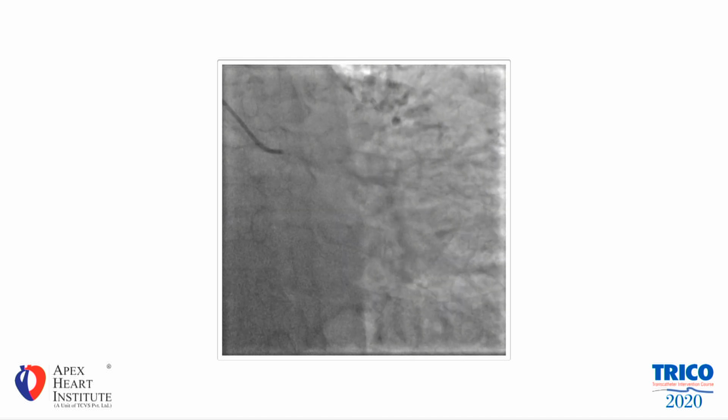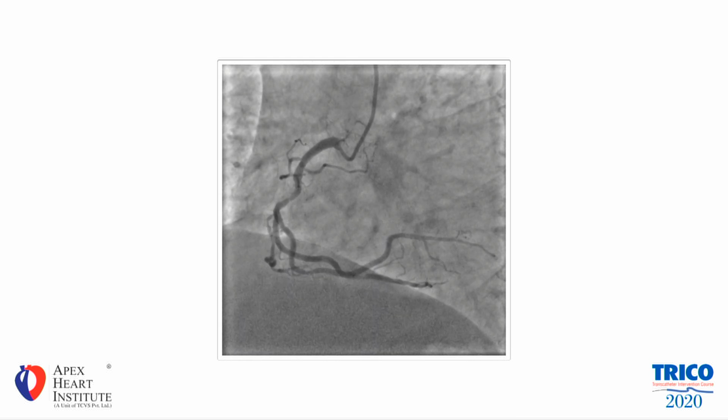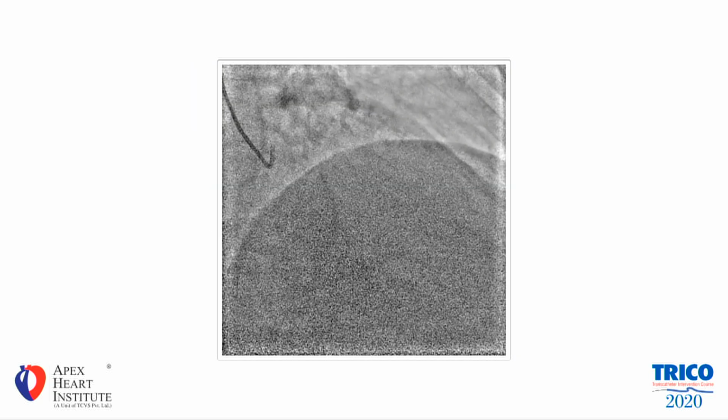OM showing around 70% stenosis, and mid RCA again showing around 60-70% stenosis. So our plan is to do angioplasty of LAD lesion using robotic technology and plus minus rotablation. Thank you. Now we are going live.